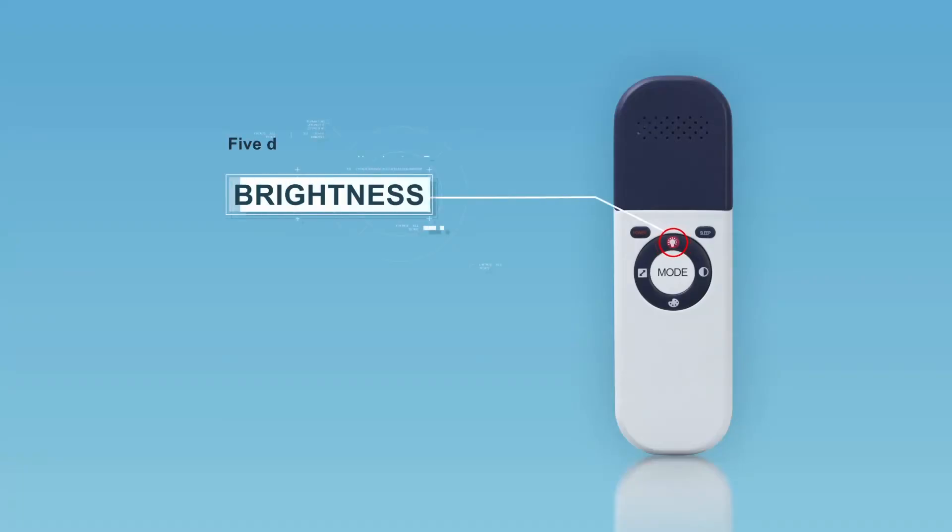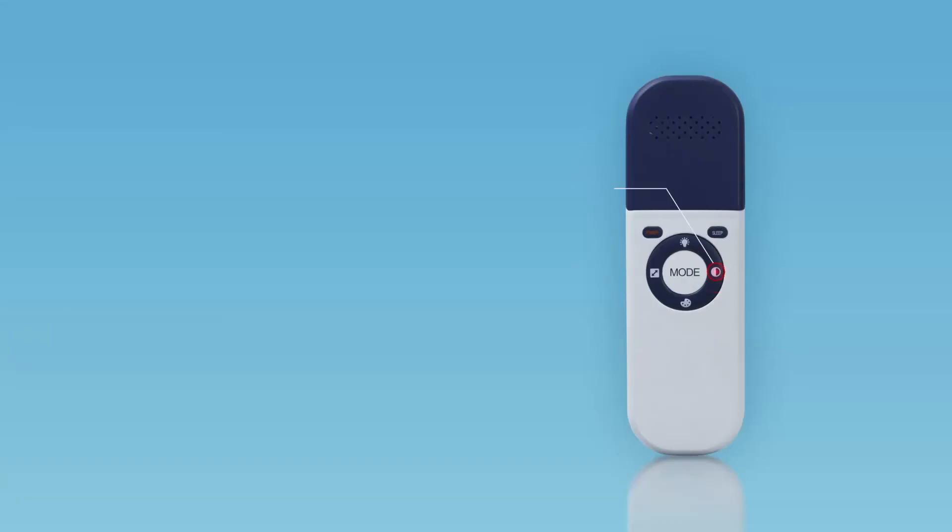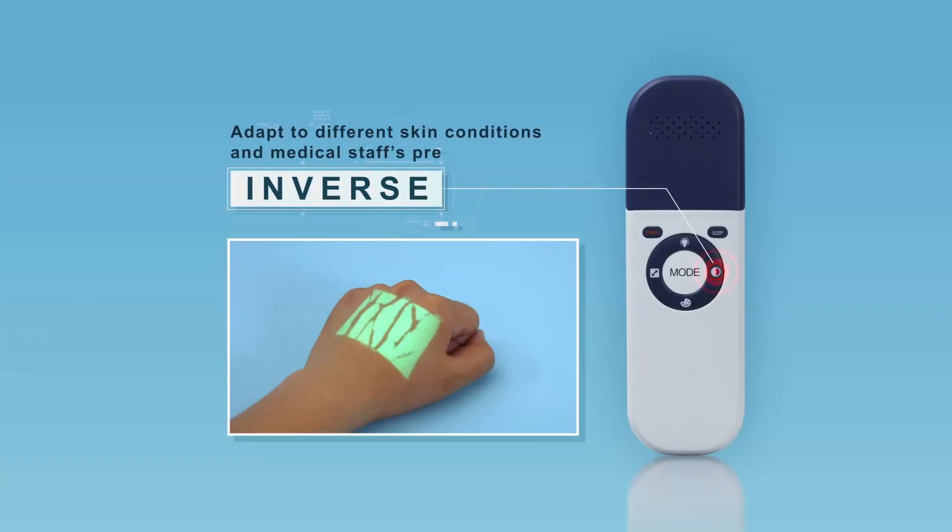Five degrees of brightness help medical staff get the best image in different surrounding light conditions. Short-press the Brightness button to change the brightness level. Inverse Mode helps the device adapt to different skin conditions and medical staff preferences; short-press the Inverse button to inverse the image.